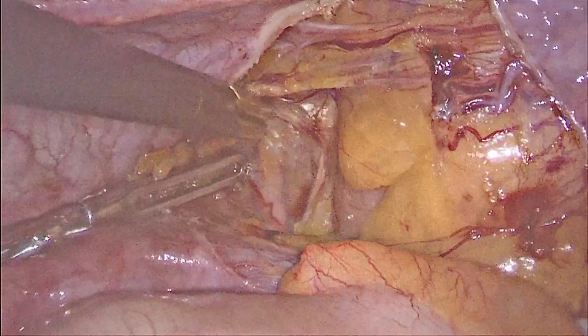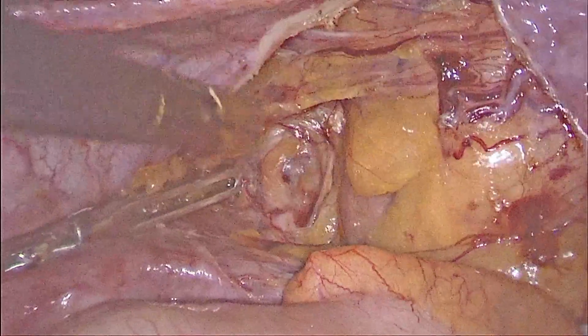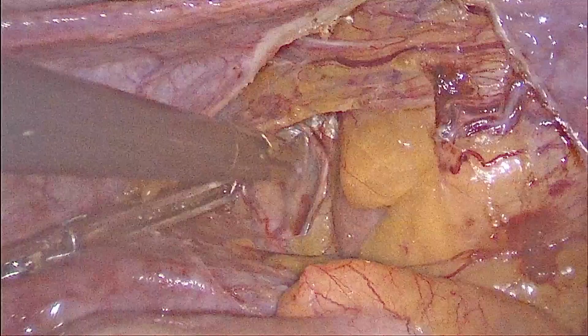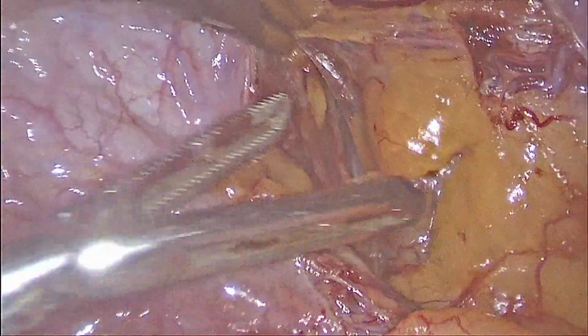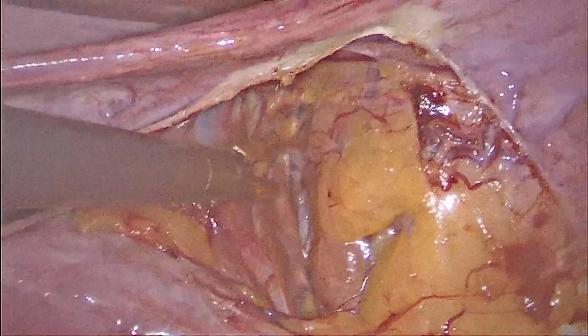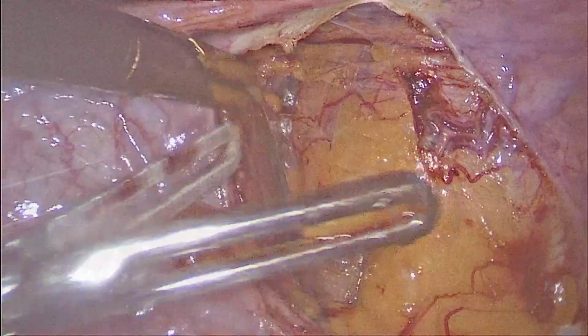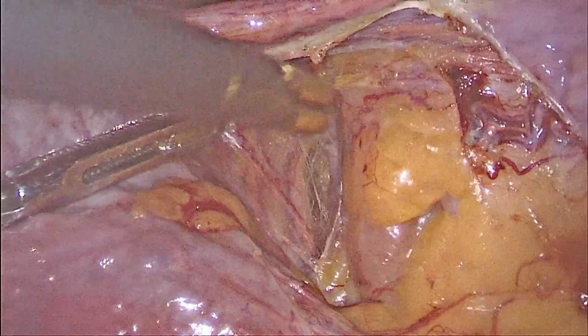Take your time and identify the structures clearly. That is loose fat covering the uterine artery.